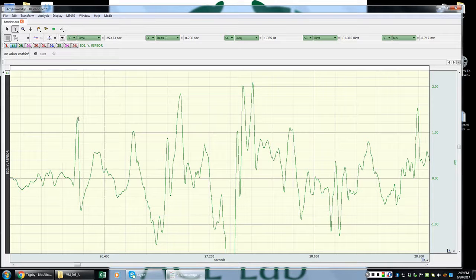Now what I want to do is find this clean peak and go all the way to the right until I hit roughly 0.72 to 0.74 seconds. And lo and behold, we're at about 0.69 there. But as you can see, if I go too far, to this peak, we're at 0.78, already a little bit too far. And if I go here, not far enough. This seems to be the most reliable in terms of the shape of the peak, its similarity with this R, and the distance is about the closest approximation.